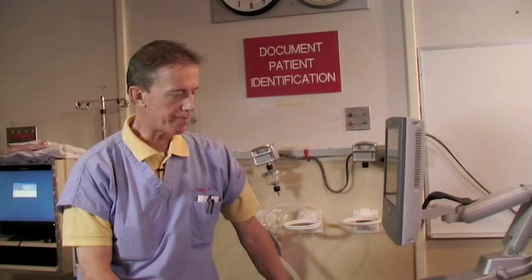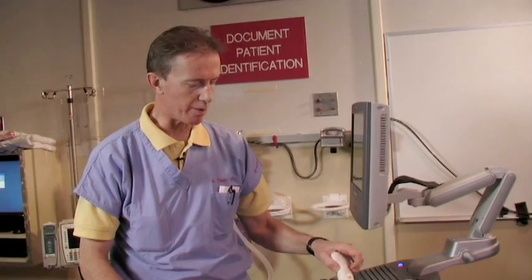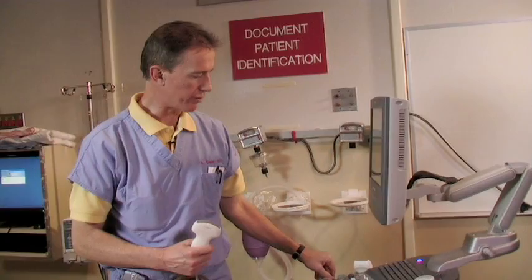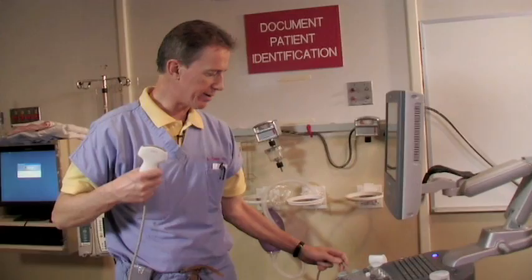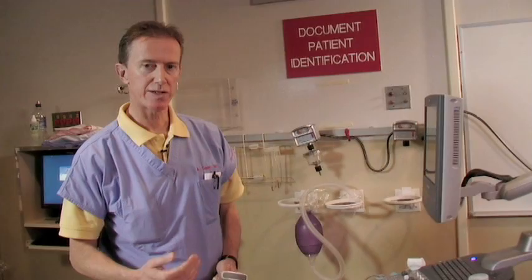The focused assessment by sonography in trauma, the FAST exam, is one of the earliest applications of bedside sonography that was widely investigated and established in our specialty and in trauma, and continues to be extremely useful, especially in blunt abdominal trauma and in certain instances in penetrating trauma as well. The key concept is that we're not looking at organs — the FAST exam is positive or negative based on the presence of free fluid in abnormal locations.